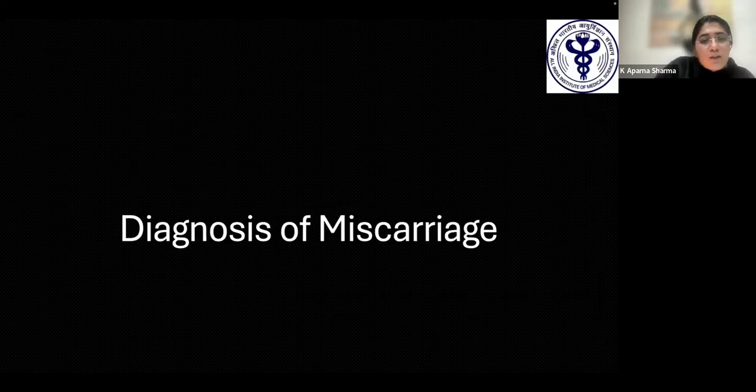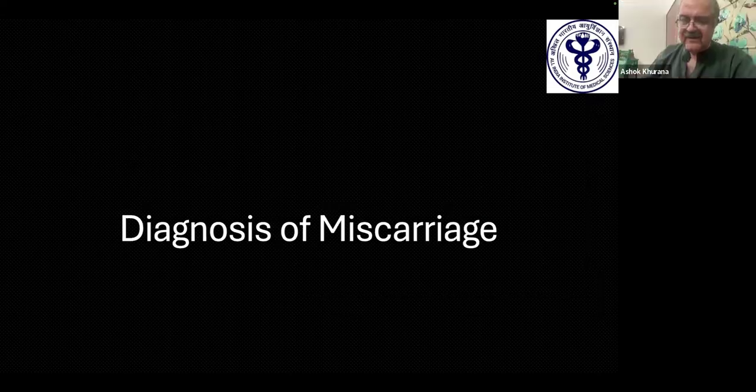So now to come to ask the sir a question. Do you think these recent newer probes give a false impression, in some cases, of subchorionic hematomas beside the gestational sac? The patient is not bleeding, there are no symptoms, but there is a hematoma-like feature on ultrasound.